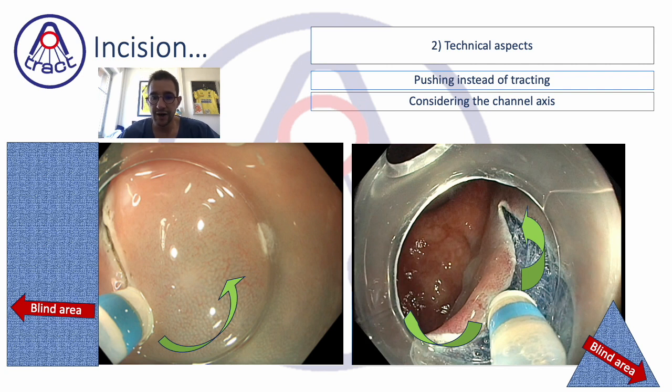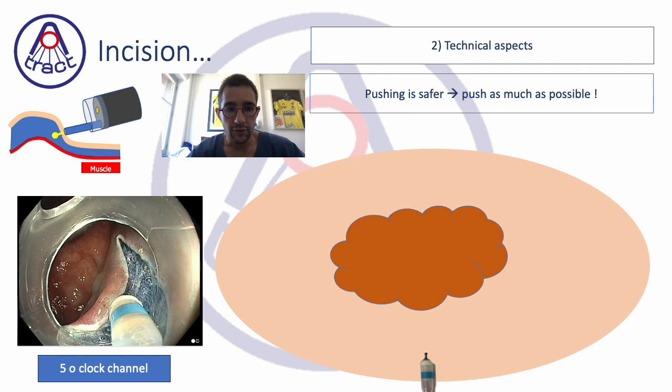because your only blind area is on the lower corner, in the right, and therefore the only area where you don't want to go is there, but it is tracking, so in fact you will never use it so much, and you will go from the bottom to the upper part, or from the right to the left, but you can adjust yourself. Depending on this axis, you will choose your strategy to always go to visible area without the blind area.